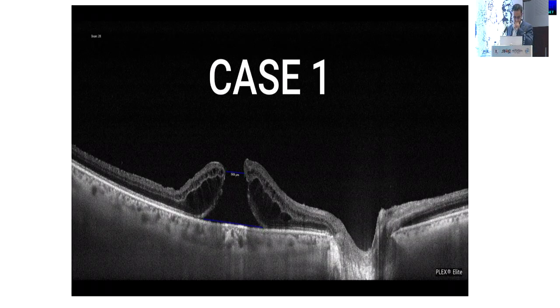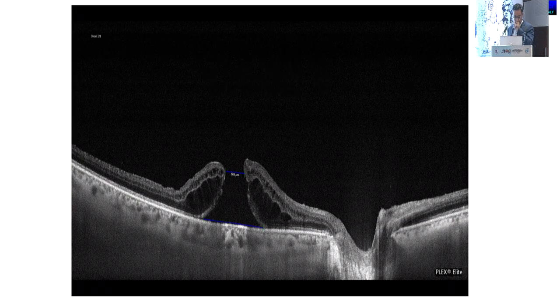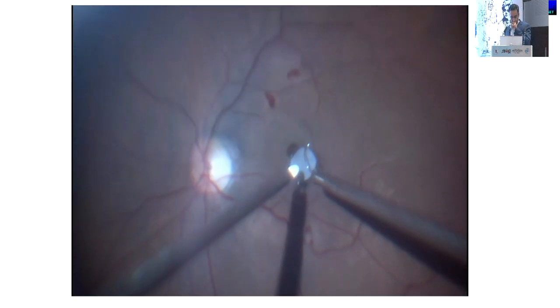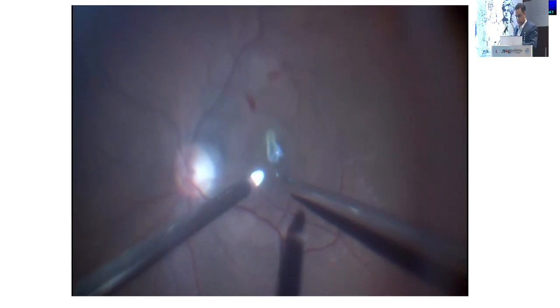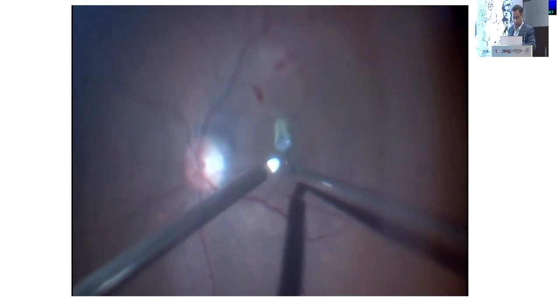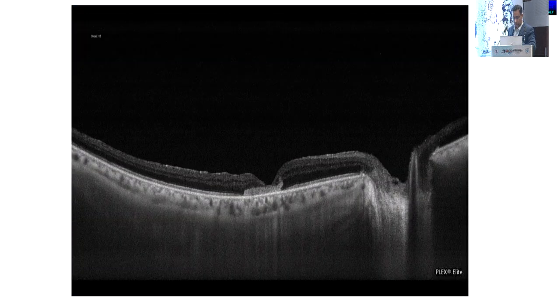This 62-year-old lady presented with failed macular hole surgery done 2 months ago. See how nicely the graft slides in with the bimanual technique using a Tano brush and a Finesse loop. Post-operatively, the hole is closed.